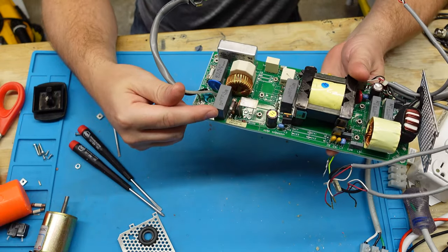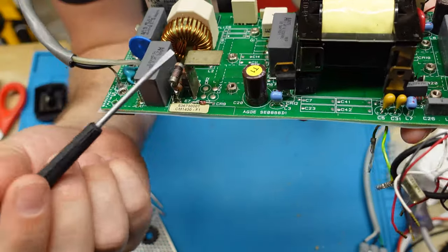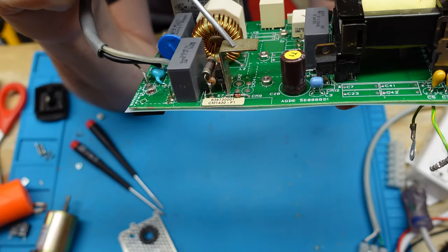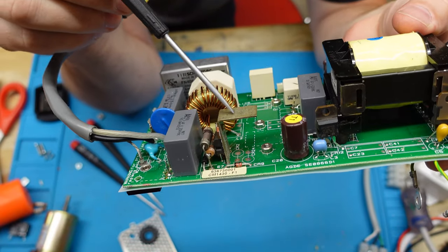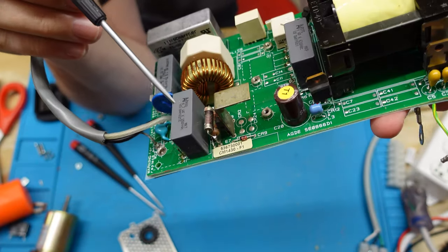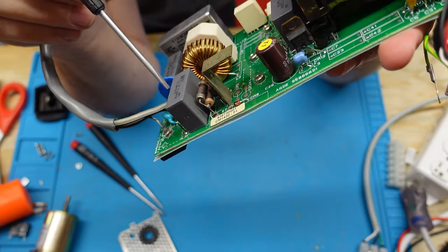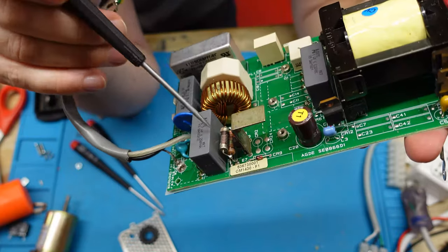And take a look at that. Wow. All right, guys. Well, right here, you can see this large metal tang, and you have a transistor mounted to it. And this appears to be a voltage regulator. That's what I would say it is, because it's got to deal with some sort of heat. And right next to it, there's two wire wound resistors right here and right here. And they're fried. They're absolutely fried. Can you see them there? So this is interesting.